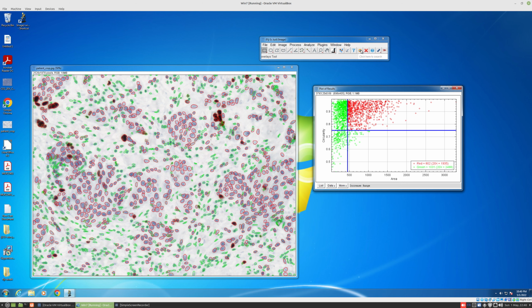You have here an icon which permits you to remove the overlay back and forth like that, and you can verify what type of work was accomplished, so you can eventually fine-tune your work.